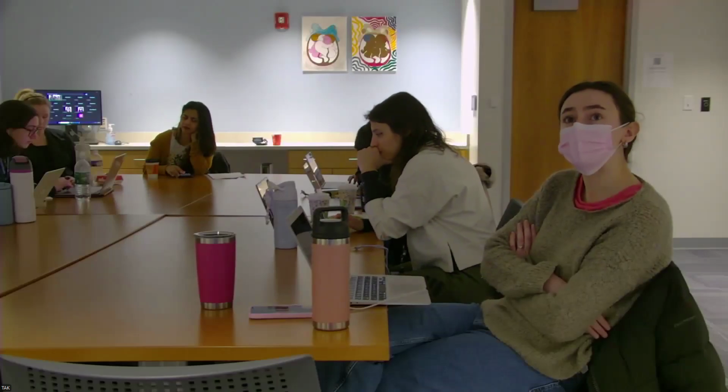This baby did have, this was an interesting case. The initial head ultrasound at 7 days of life was normal. But then we also repeated one on day of life 30 to look for leukomalacia in the periventricular area. And this baby had a significant amount of PVL. So whether there was some ischemic insult to those areas prior to, or in the first week after delivery, it's really tough to say, but we'll be following with neurology and get an MRI.